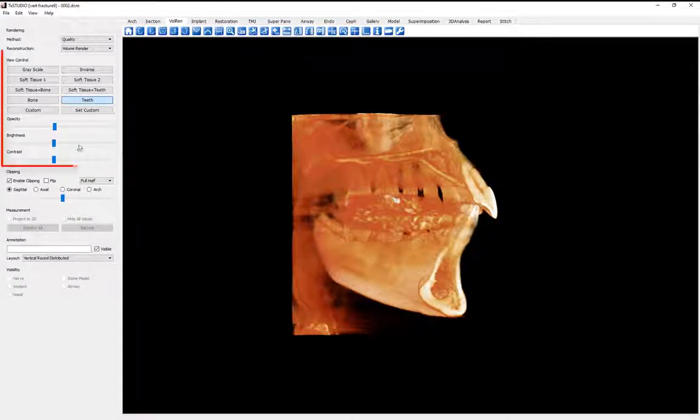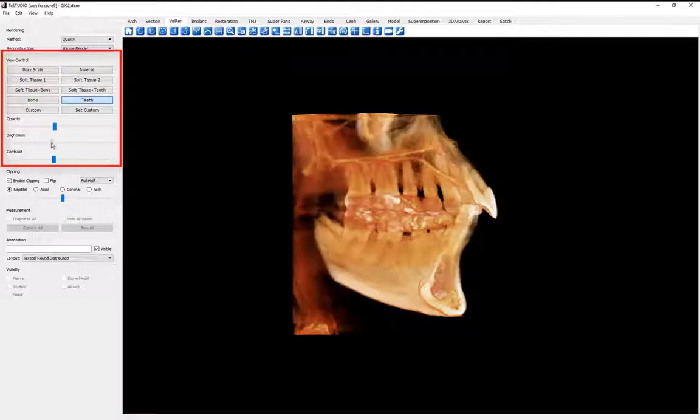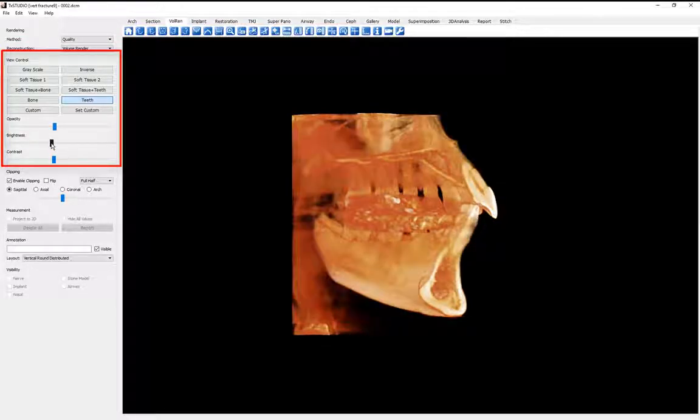Use the control panel view controls to change the image characteristics if desired.